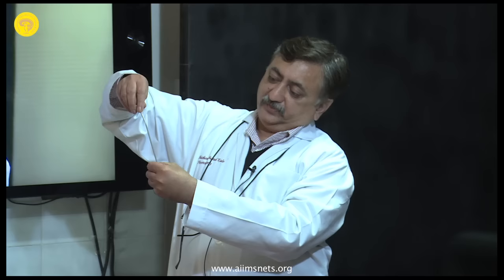So that's the direction of your screw in the S1 for me, for my side. And from the other side, it's got to be downwards, medial, and in the pedicle. So that's S1. There are other ways of identifying the entry point.